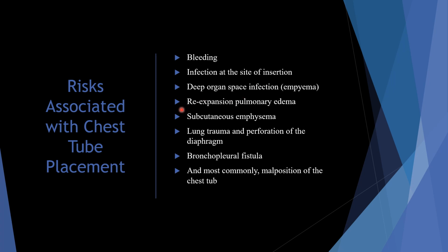I want to go back to the re-expansion pulmonary edema. This is something that does not happen very often. It only happens in maybe 1 or 2% of the patients. When you put a chest tube in, immediately after you do it, especially if you have a pleural effusion and you drain the fluid out, they get that little cough going on, right? And it may last for an hour or so. That's from the re-expansion.